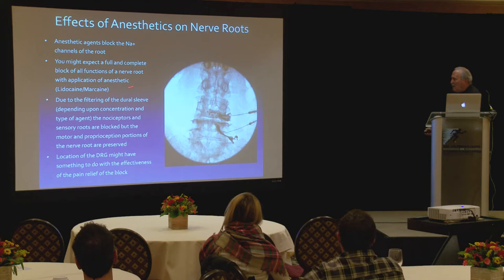So effects of the anesthetics. There's two things injected generally, actually three, when you do a block. One is the dye, because you're trying to figure out if you're in the right spot. Number two, the steroid. And number three, you have an anesthetic. You have lidocaine or marcaine.